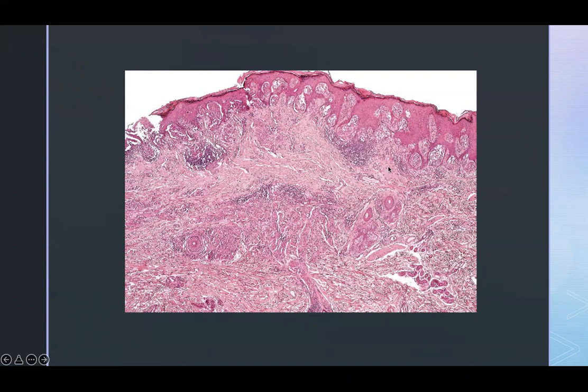But let's say that the scar was limited to here, but the junctions went 3 or 4 times the length of that scar away from the scar, and the normal collagen was below. That would become more worrisome. So this would be a good lesion to maybe do a PRAME on and make sure that that PRAME is negative. Again, I'm not advocating to rely completely on PRAME. I'm just saying you can use it as a tool. You could also maybe send it for molecular testing like FISH or some type of NGS analysis to examine whether or not it has a melanoma related signature.